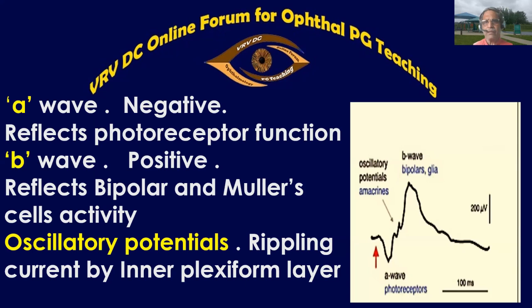Now, this is the normal ERG I will tell you about. We have the A wave. In a typical ERG, that's a combined response.